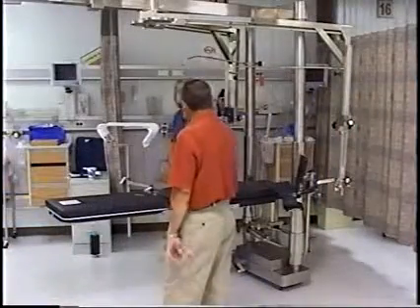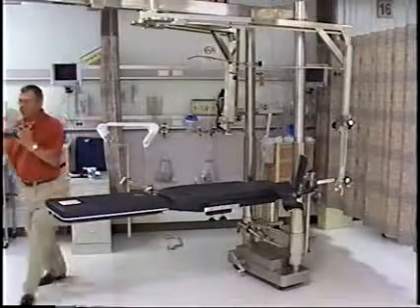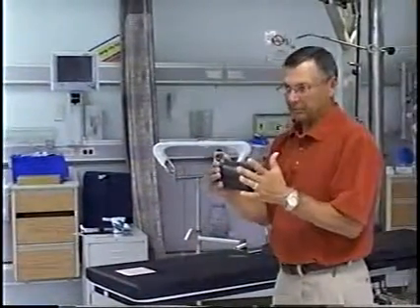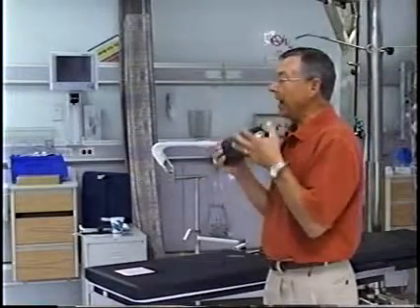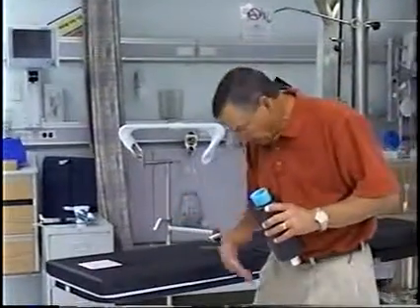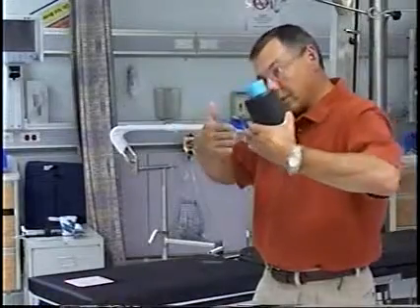One of the, and you brought up a good point, Pat, about wrapping. The perineal post is padded. It's padded. But I would highly recommend, especially with men, especially with young men who want to have children, that you wrap this and pad it even more. Because when they start to pull traction, let's say it's a 30-year-old guy who rolls his motorcycle and breaks his femur, the doc's going to pull a lot of traction because remember, femur, largest bone, strongest muscles, an awful lot of traction, to get those muscles pulled back to realign that bone.